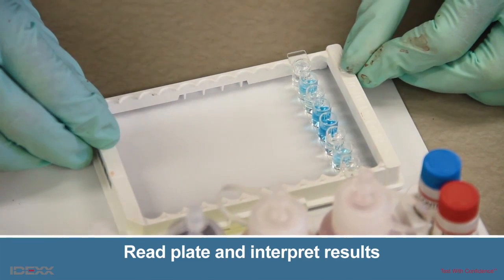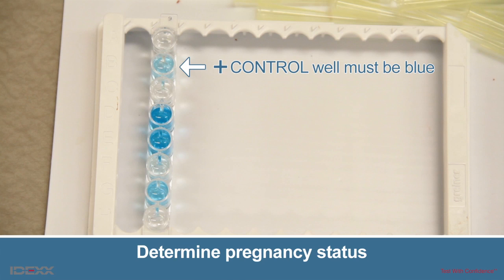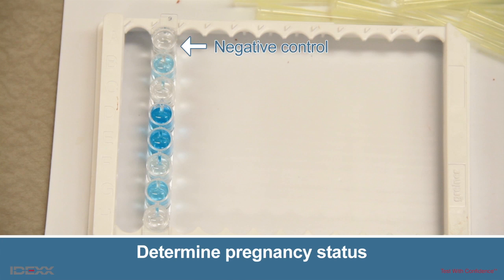Note: in order to have a valid test, the positive control well must turn blue in color. If the positive control well does not turn blue, all results for the assay are invalid — repeat the test following a thorough review of the insert. Blue color development in the negative control well indicates insufficient washing. The pregnancy status of each animal is determined by comparing the color development of the sample well to the negative control well.